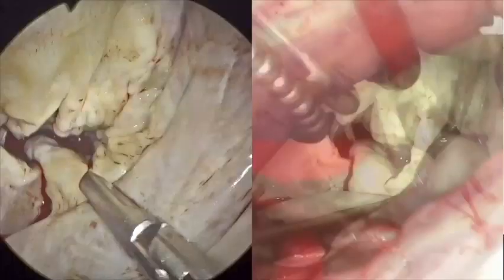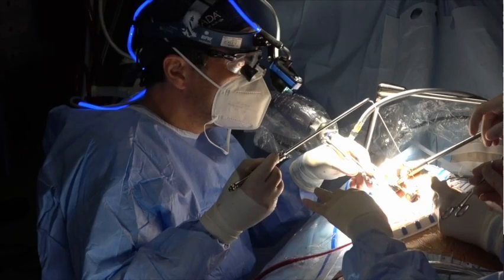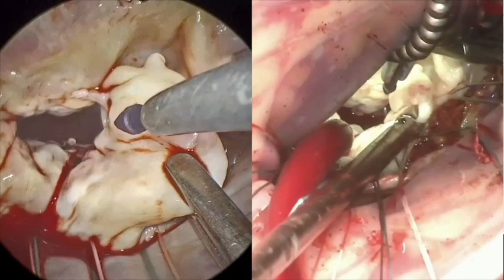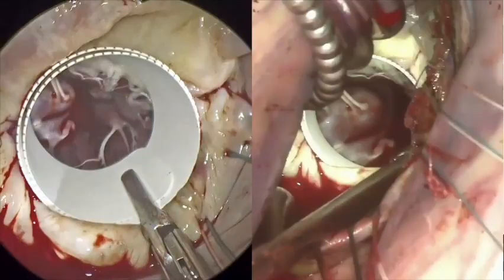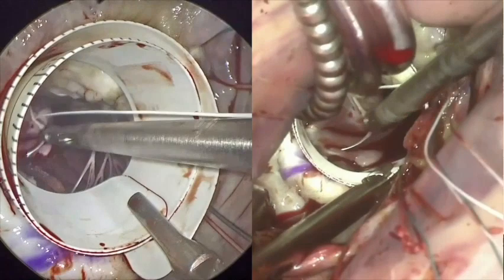On the left you see the endoscope view and on the right the head camera view. We pass posterior annular sutures, always going from the anterolateral to the posteromedial commissure. This is the huge P2 flail with a lot of broken chords. Here we mark the prolapsing segment and use a ruler to get access to the subvalvular apparatus. You can see how with this direct view you get superb access to the papillary muscle with a natural 3D view.